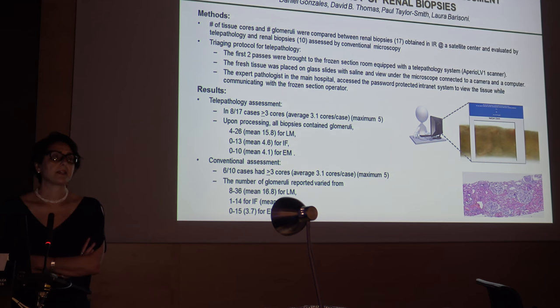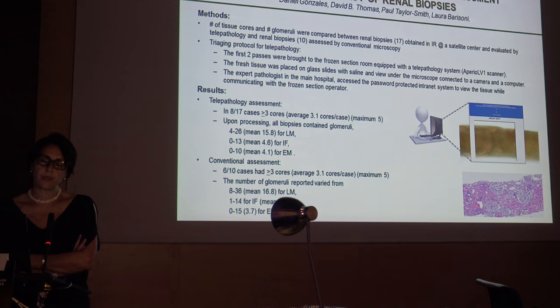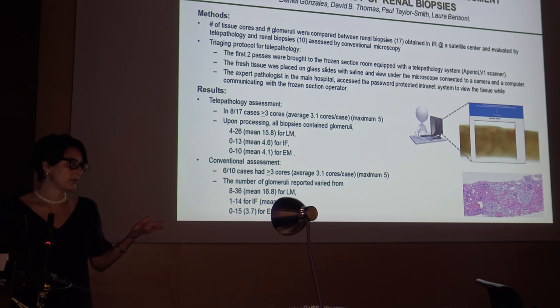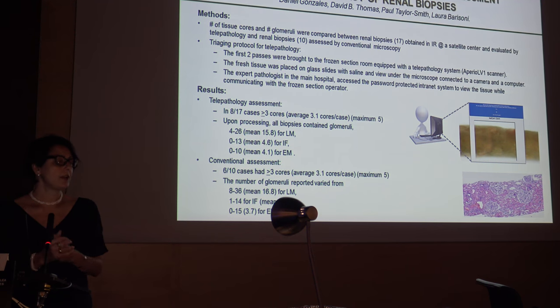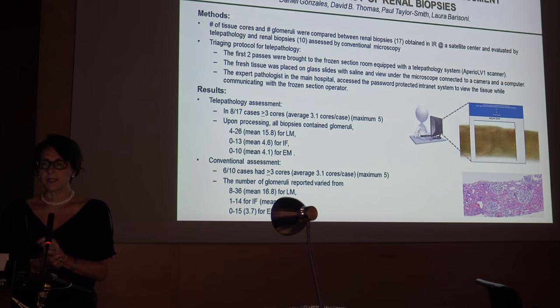We had biopsies that are done in satellite centers, and so we connect and we evaluate the tissue. To validate this process, we took 17 consecutive renal biopsies done in a satellite process center. And we compared them with the biopsies that were done centrally, where we are present at the time of the biopsy.